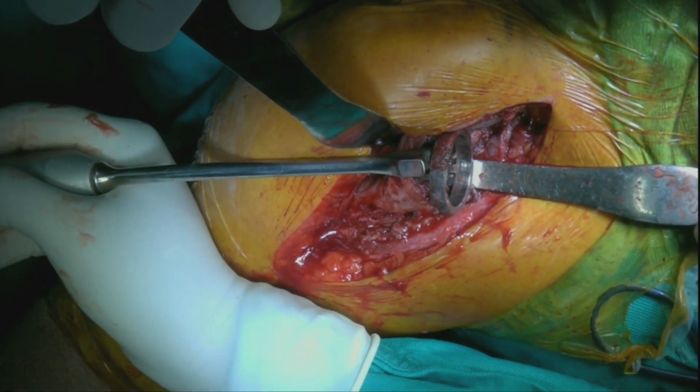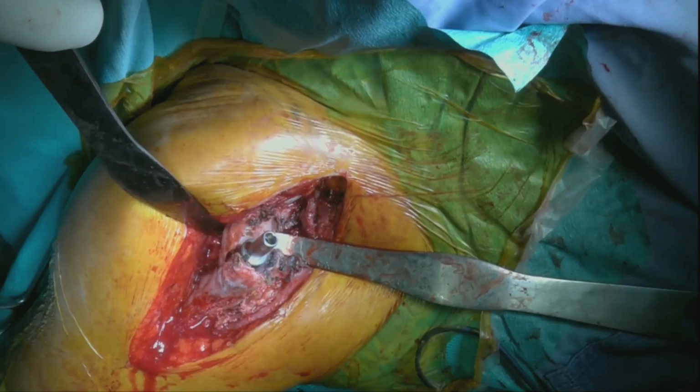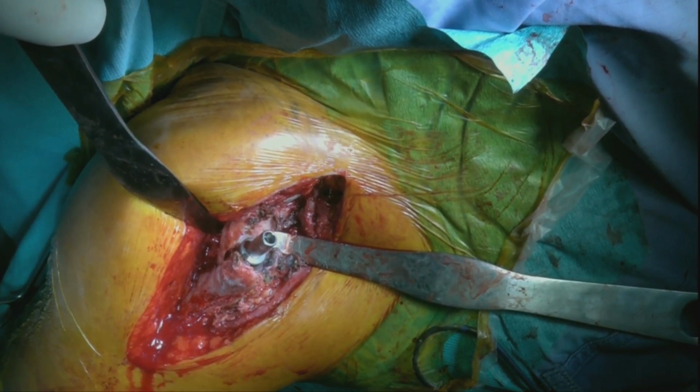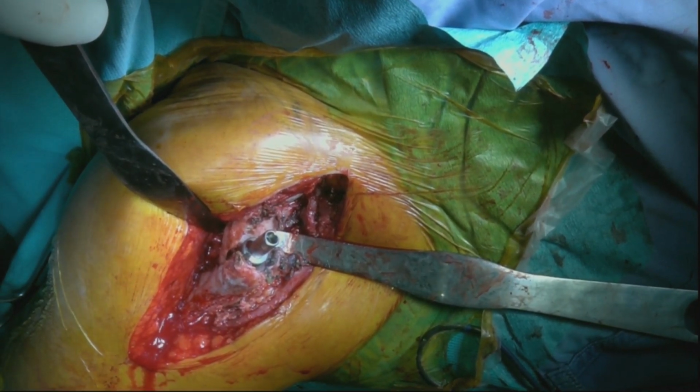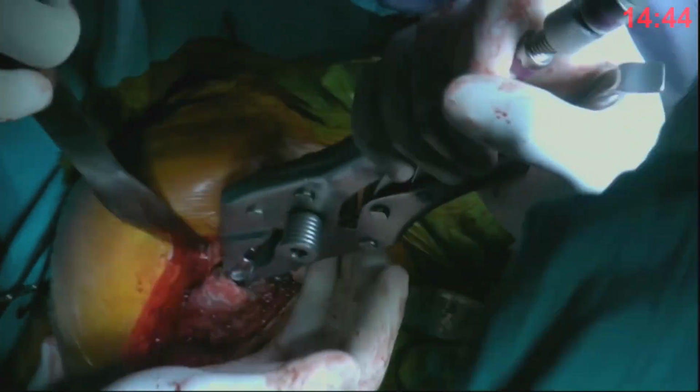Okay? So as was said this morning, we try to respect the proximal humerus to save the bone. And we try different techniques, as Dr. Palladini said, to remove the stem that was cemented. Fortunately, we are ready for everything. Of course, otherwise you cannot face this kind of surgery.